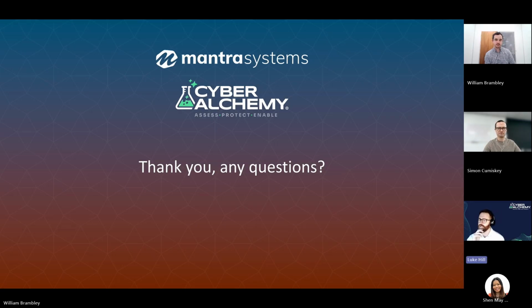I think just to add a little bit to that as well, though it's not really around the compliance documentation, as you're going through that development life cycle, having cybersecurity people in there that can apply that hacker mindset, like Simon mentioned earlier with Barnaby Jack, right? It's very obvious that he has that hacker mindset. Applying that, you can understand or at least identify some of the things that might go wrong from a cybersecurity perspective. And then you're in a much better and more defensible position to put in the right level of control to address those risks. But if you don't have that technical awareness and hacker mindset, then you might miss threats to your system.